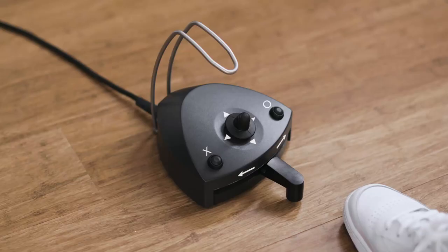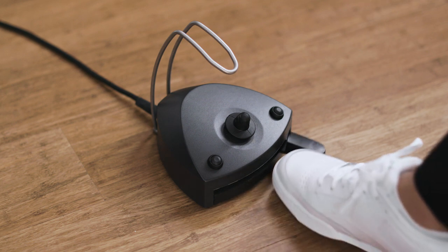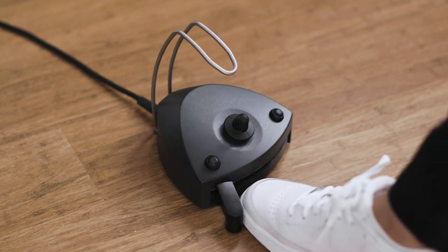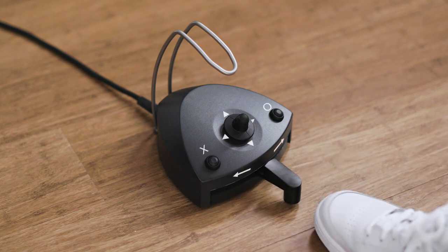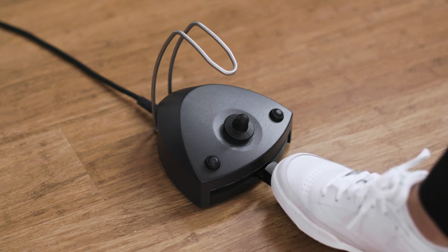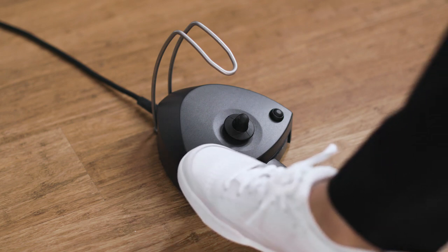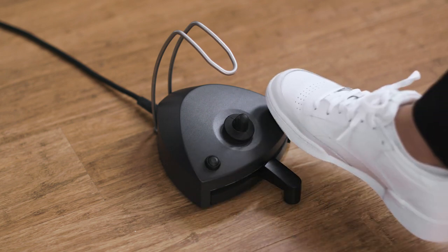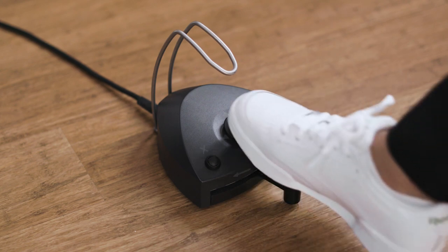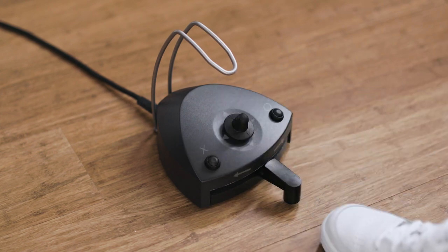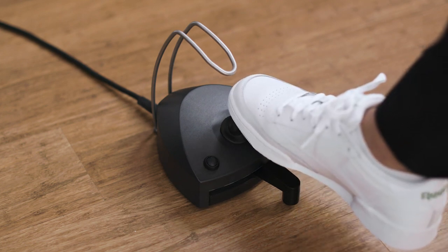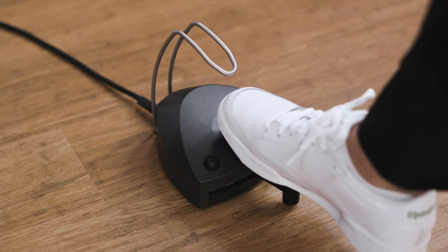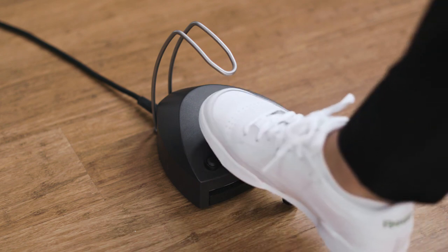The foot control has a pedal that can be moved to the right, to the left, or pressed down, an X button, an O button, and a joystick that can be moved north, west, south, and east.